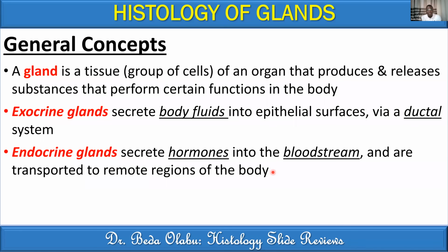So the subject matter of this class is to focus on the endocrine glands, and you already know which kind of endocrine glands you're going to focus on, so I don't have to give you examples of them.